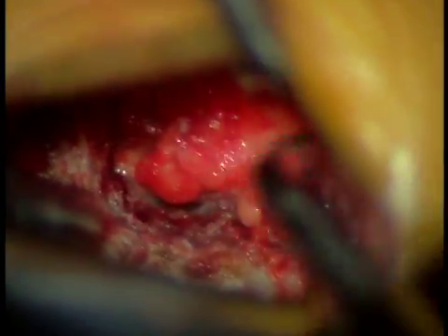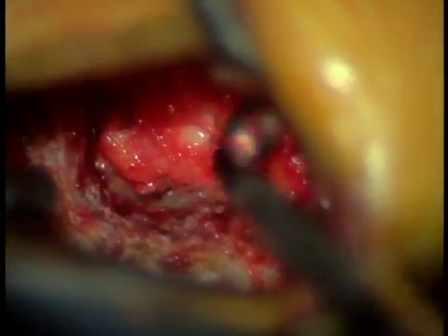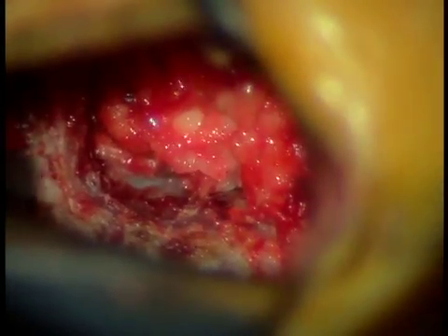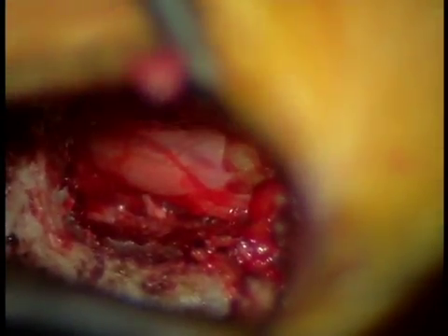Here you can see we're using a Kerrison rongeur to remove the bone, and then we'll start to remove the ligamentum flavum. The ligamentum flavum, as you see here, is a vestigial ligament that really doesn't help us much in day-to-day living and it's easily removed.